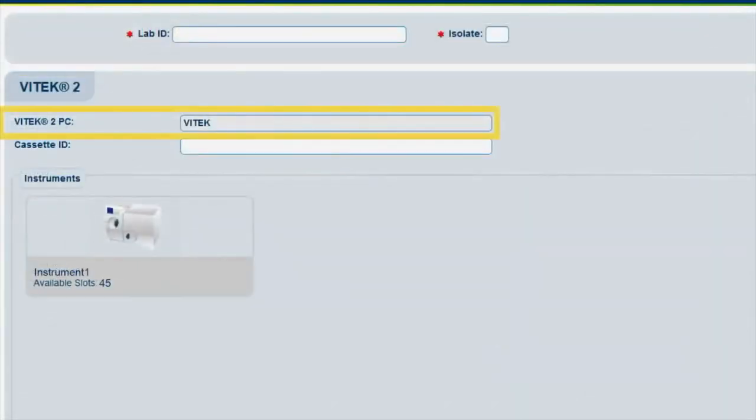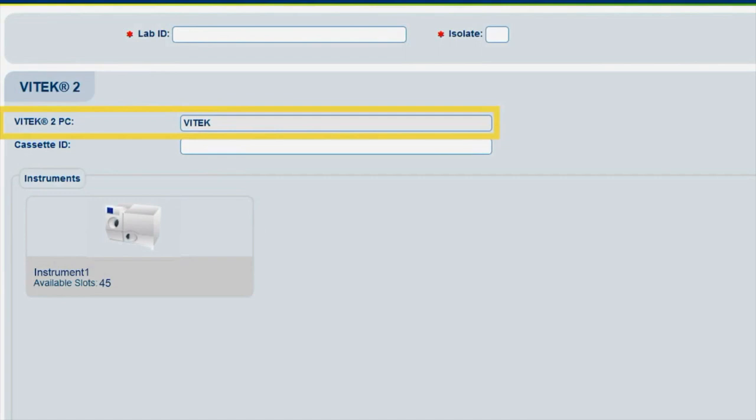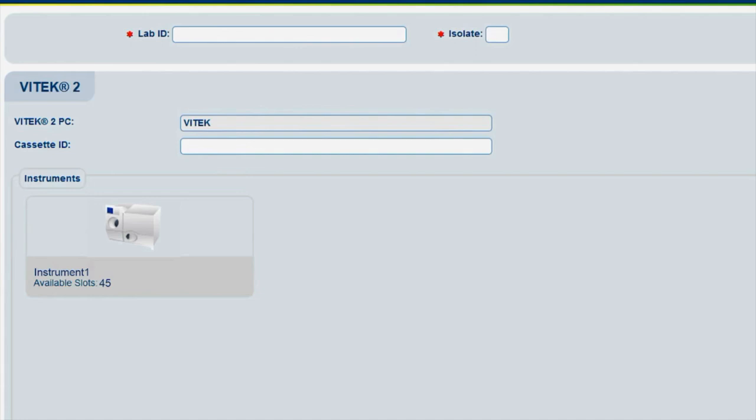The Vitek 2 PC field displays the PC to which the FlexPrep cassette will be sent. When connected to multiple PCs, more than one PC option is available for this selection. Only one PC will be used for this video. Cassettes created must be loaded into an instrument connected to the selected Vitek 2 PC.